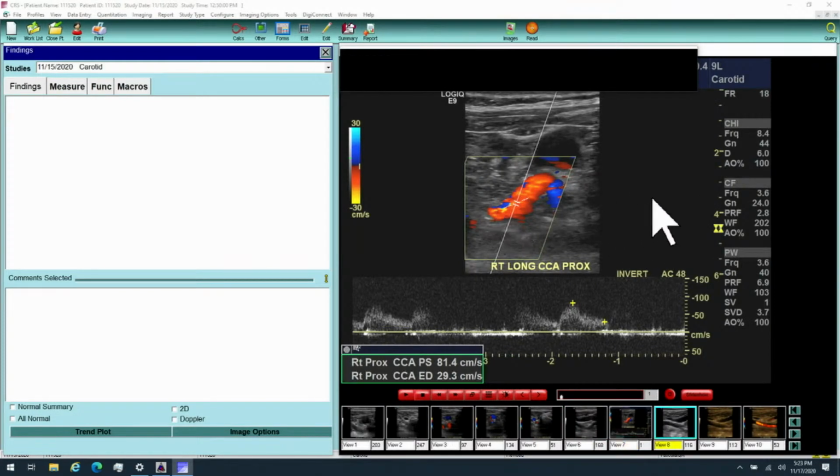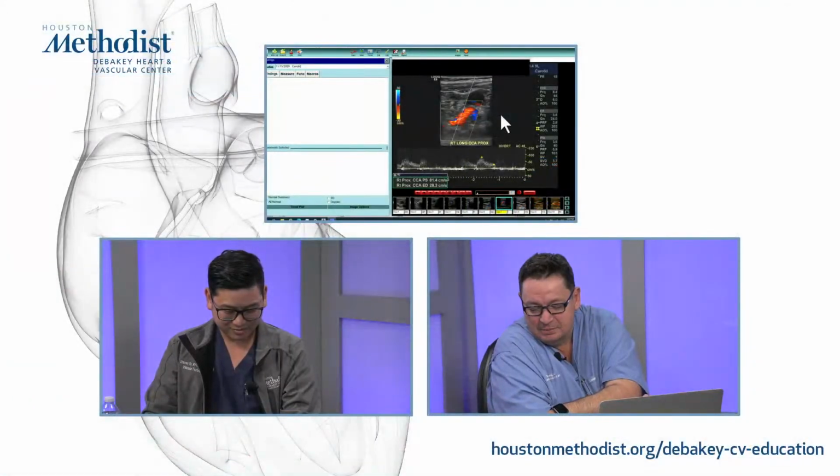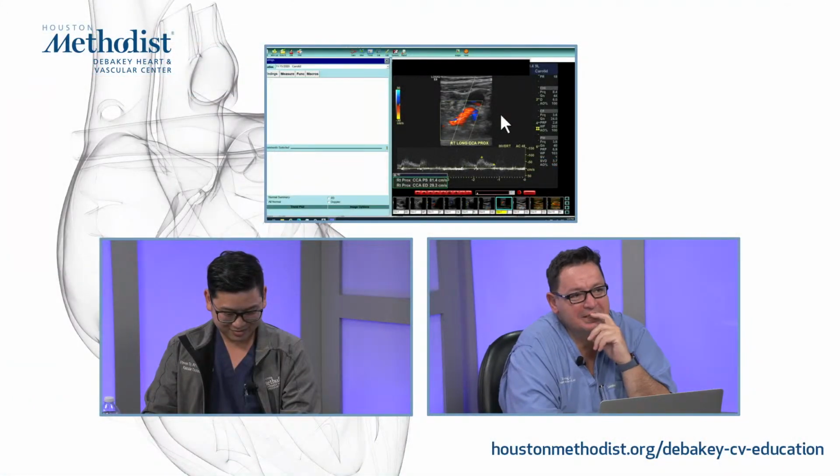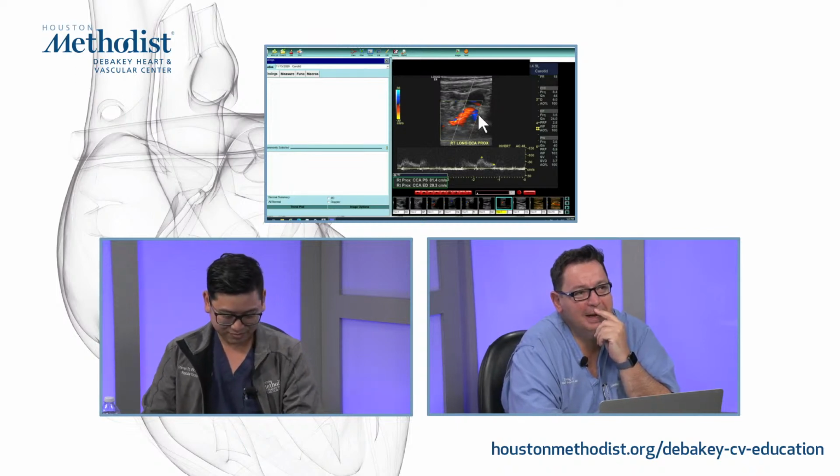All right, 81. Yeah, let's critique it. Oh, yeah, sure. If you did critique your own work, let's critique someone else's work. Fair. Please. Sure. I think you're too generous not to critique. Again, this is not your study, but I ask you nicely because you have a special connection to this case as well. Yes.